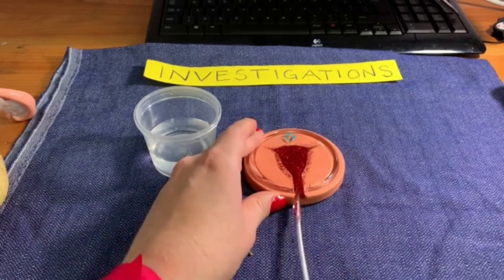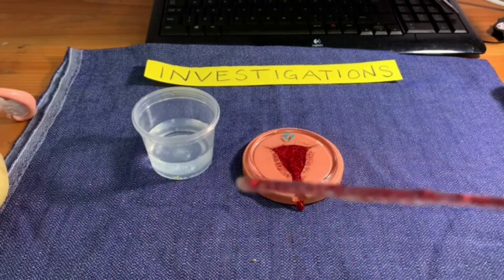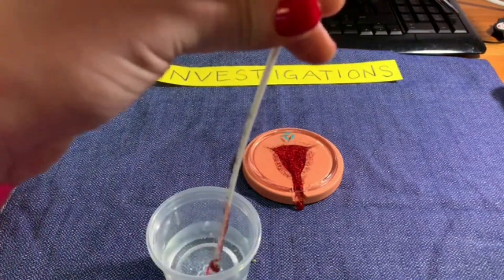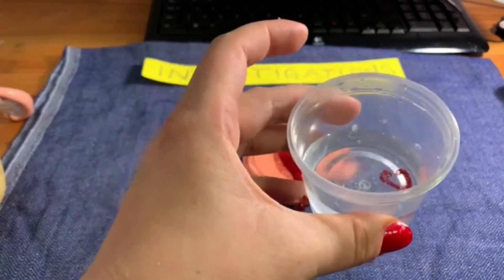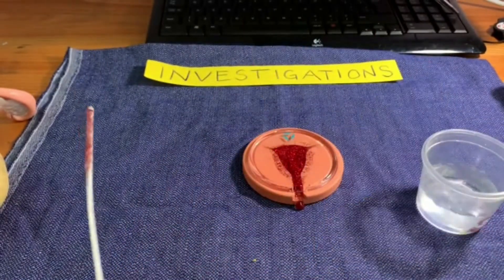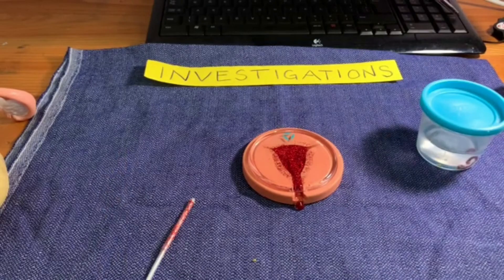You use the pipelle to pull some of that tissue out, and you get a whole long string of endometrial tissue — it ends up looking like a little worm. That gets sent off to the lab in formalin for histological examination of the endometrium. So those are three of the very basic gynae investigations, and we'll discuss others in the PowerPoint slides.